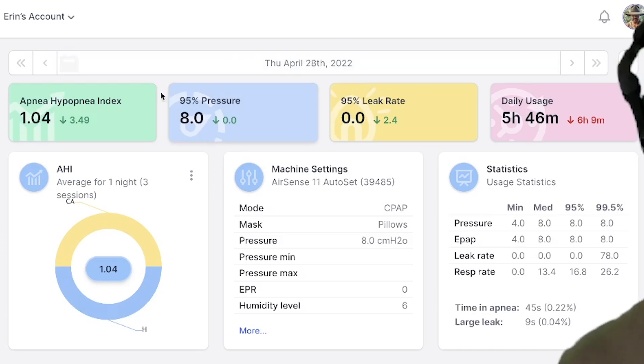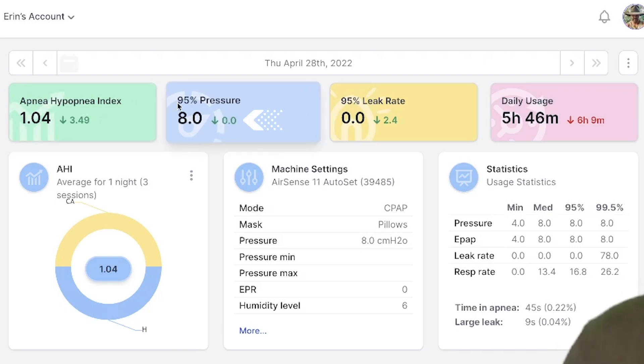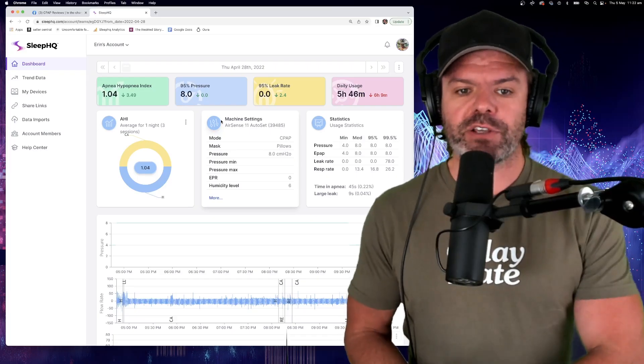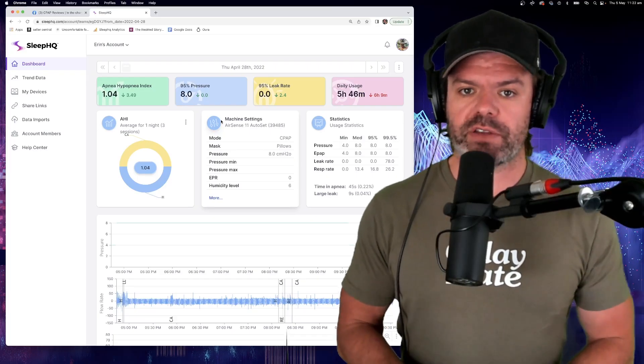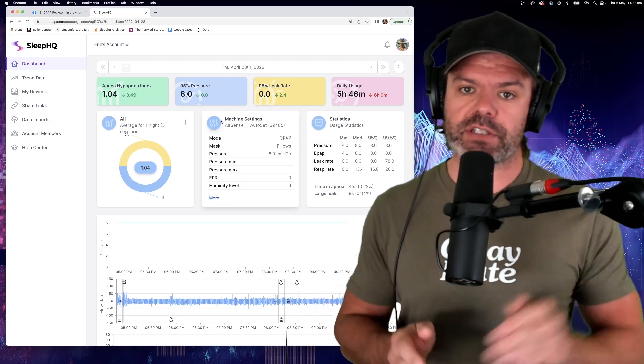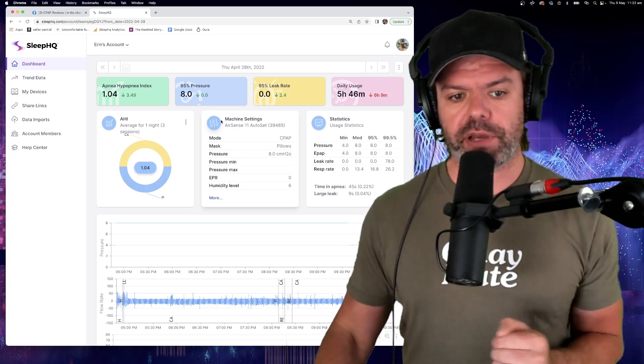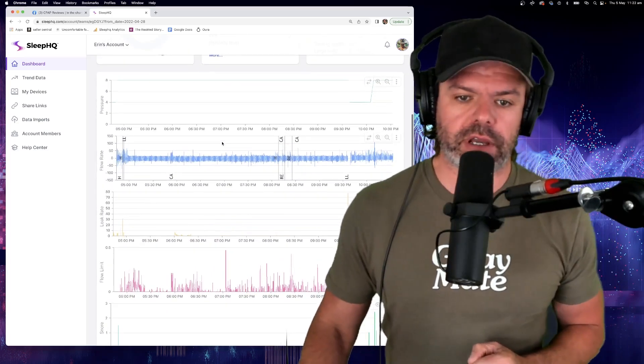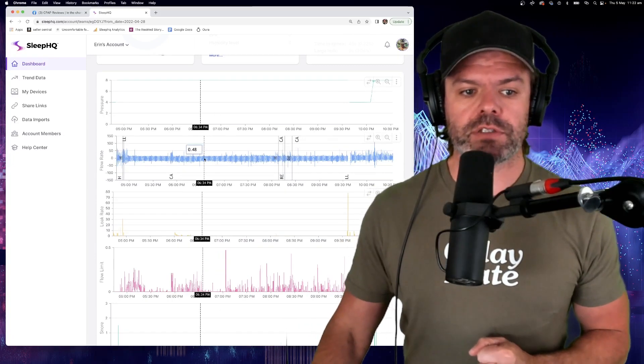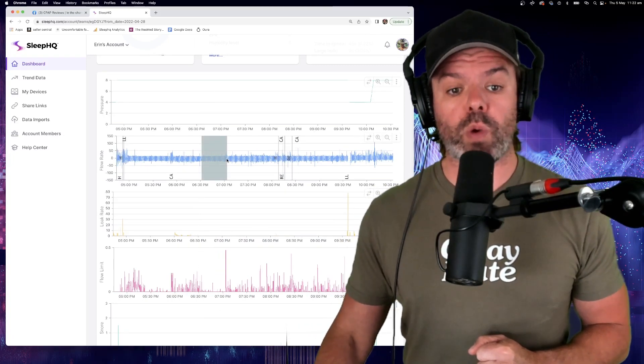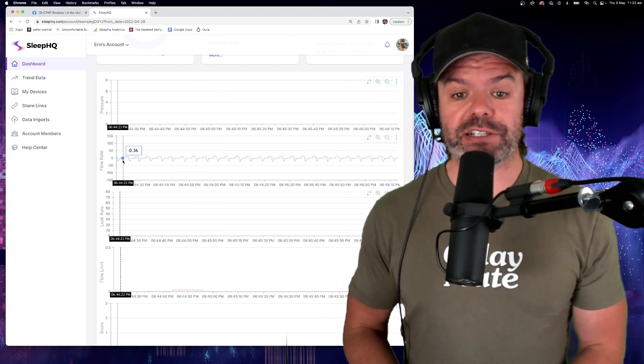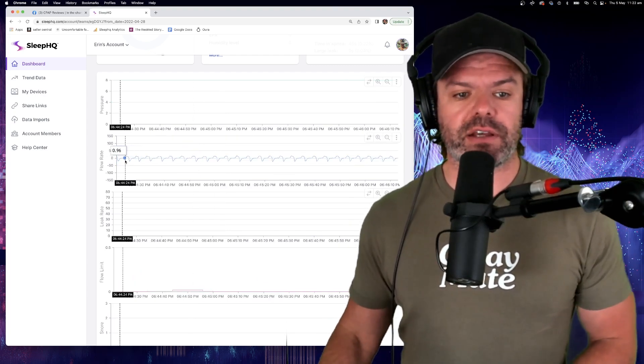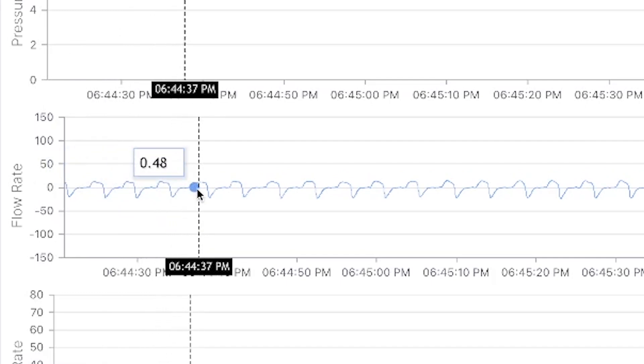She's got an apnea hypopnea index of 1.04, which is down on the previous day. Her 95th percentile pressure is eight centimeters, great leak rates and reasonable daily usage. Now, Erin's currently using an AirSense 11 autoset device, but she's using it in CPAP mode fixed to eight centimeters of pressure and she's using a pillow mask. So let's come down here and have a look at Erin's breathing. All right, I'm going to zoom in on the flow rate, which is otherwise known as the waveform. And you can see here Erin's breathing is looking really nice, really consistent. You could draw a ruler across the top and bottom, nice stable breathing. That's what we want to see.